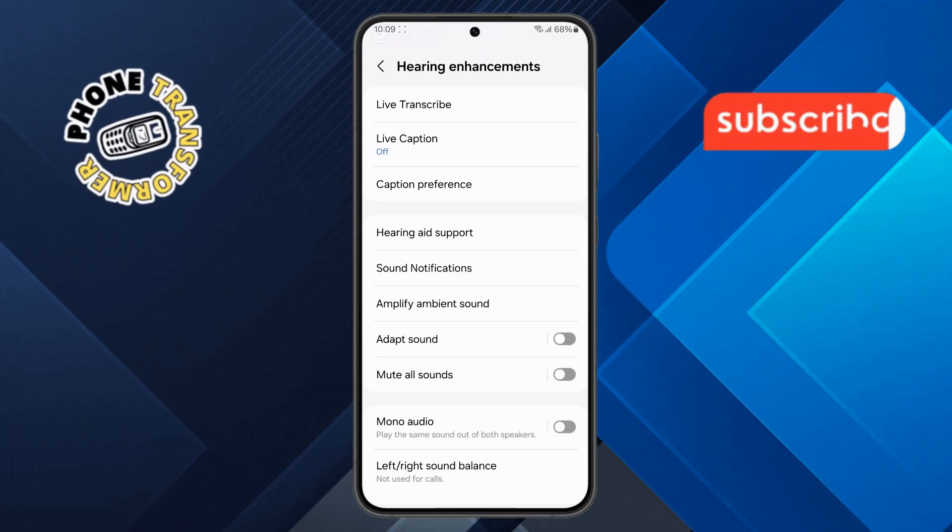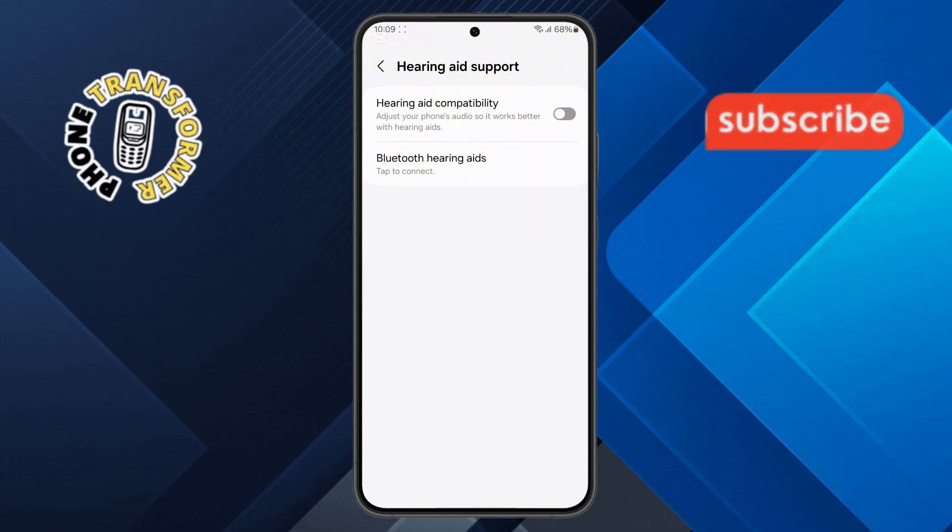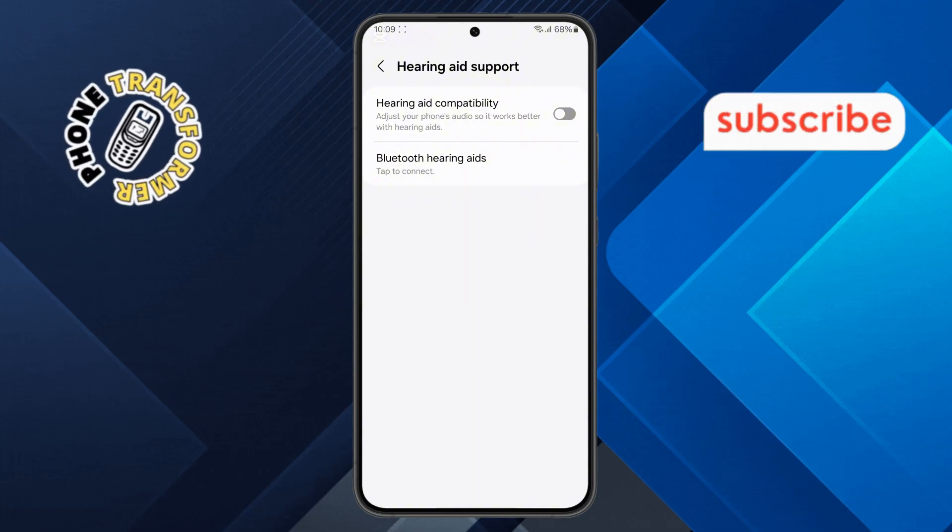Step 4. Inside the Hearing Enhancement menu, you'll see an option called Hearing Aid Support. By default, this option is turned off, but don't worry — we'll enable it in the next step.